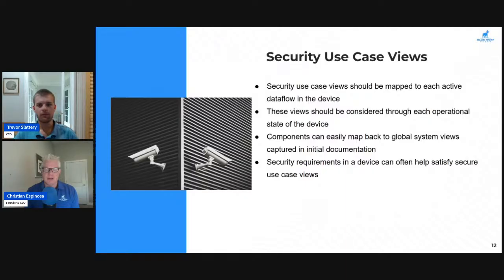We've been talking quite a bit about data flow. From your experience, our team's experience with device manufacturers and the developers of the device, do most of them actually understand the data flow of the device? So the manufacturers of the device, for the most part, have a fairly solid understanding of what it's doing from a functional perspective. But where the knowledge gap generally comes in is how security is going to be relevant, understanding what a data flow is capable of.